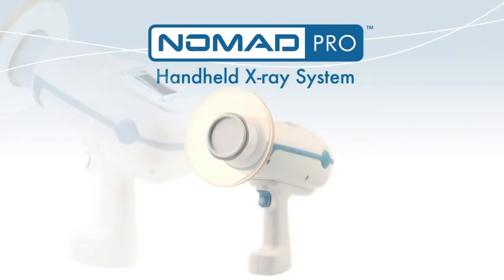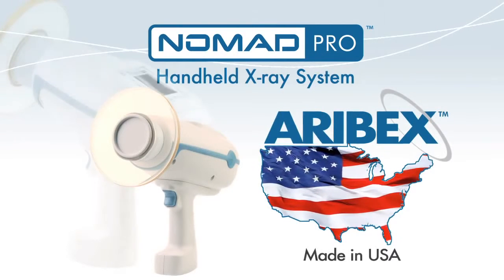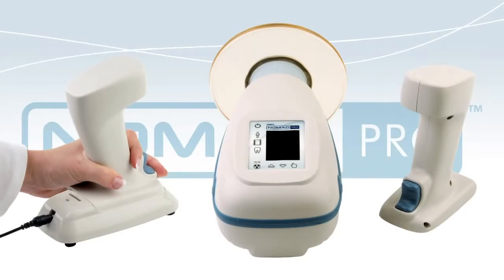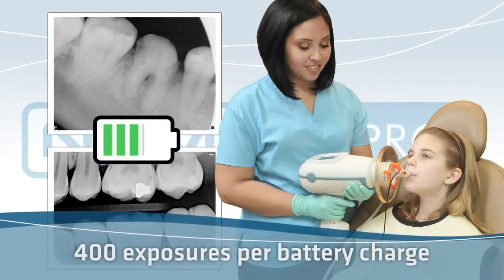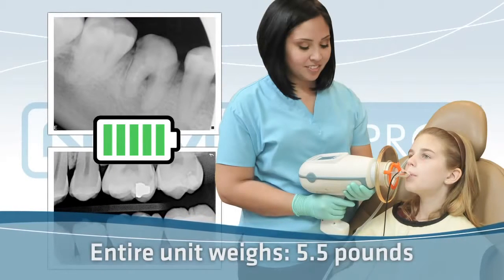Nomad Pro is the second-generation handheld intraoral x-ray by Aribex, a US-based manufacturing company. The Nomad Pro is rechargeable and comes complete with two battery handsets and a charging cradle. Its state-of-the-art lithium polymer technology provides up to 400 exposures per battery charge. The entire unit weighs only 5.5 pounds.